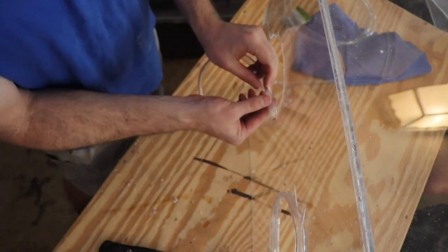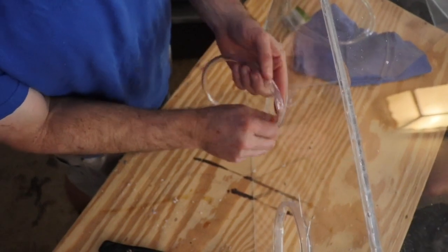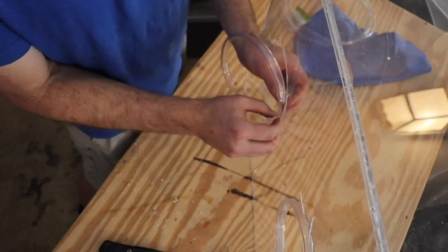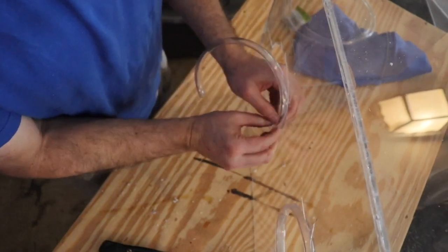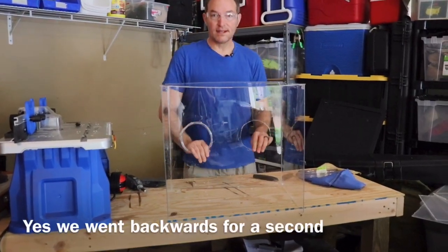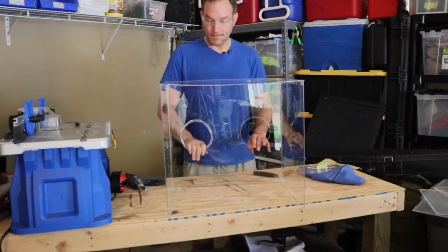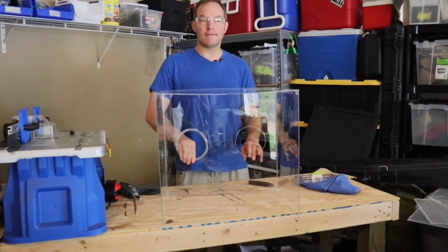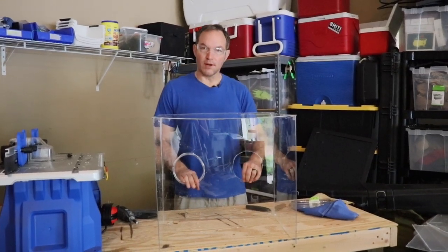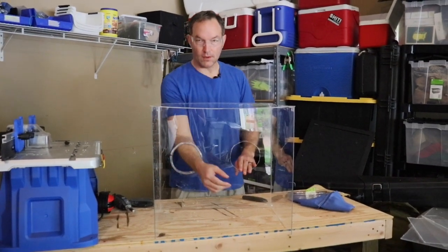All right, then we start feeding it around. Just split it, and I'm sliding the tubing as I'm splitting it as well. Try to get it all on there. There you go. Much better. So if you have something like that, great. You can use that. If not, this is still okay, I think. The other side without it, it's still way smoother than it was. I got all those rough burrs and edges off, but I think this will just be a whole lot nicer to have that there.